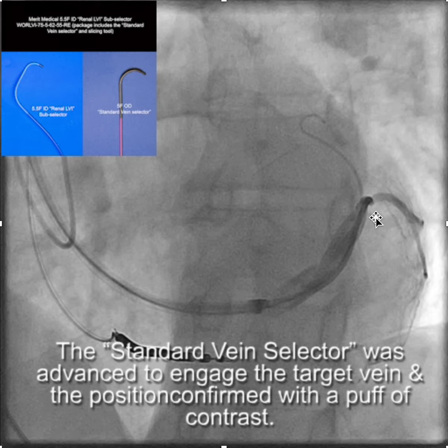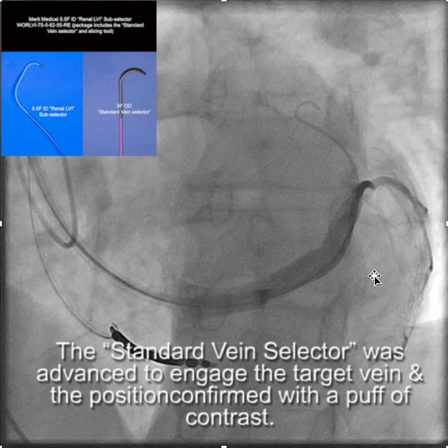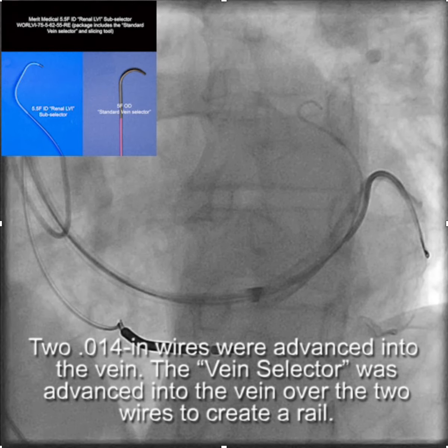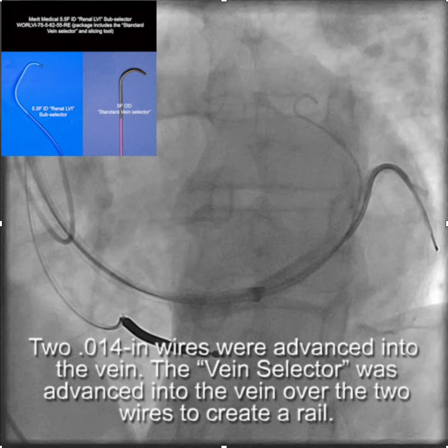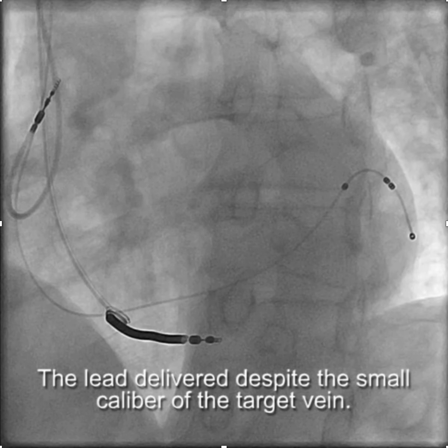Here you can see we've engaged the branch and injected contrast to confirm we're in the branch. We identified side branches and chose the larger of the two, placing two 0.014-inch wires into the vein. We then advanced the vein selector over the wires as deep as we could into the vein to create a rail. Using the wire-stabilized vein selector, we advanced the renal LVI sub-selector into the branch and from there advanced the LV lead into the vein, achieving a good result.